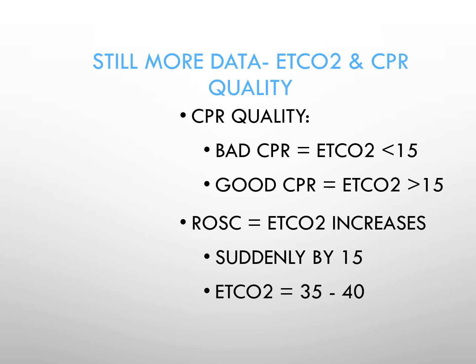Some of the thresholds to consider regarding capnography and CPR are as follows. I'm always a little cautious to use a hard and fast cutoff, but just as a guideline, when the end-tidal CO2 is considerably less than 15, it's suggestive that the CPR needs to be improved. If it's greater than 15, it's also suggestive that the CPR, particularly the compressions, are adequate.